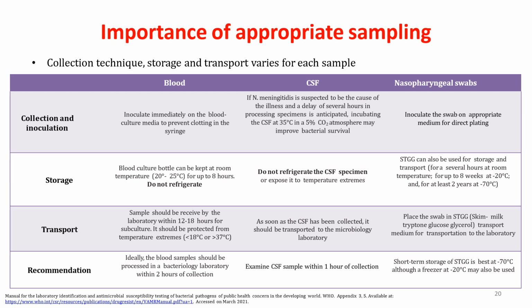If fastidious organisms like Streptococcus, Haemophilus, or Neisseria meningitidis are suspected, then it should be incubated in a 5% carbon dioxide atmosphere or 5% carbon dioxide incubator. If it is not available, or better, the CSF sample should be inoculated into enriched media such as chocolate agar or an automated blood culture bottle to increase the yield of the pathogens, especially for organisms like Streptococcus or Haemophilus.